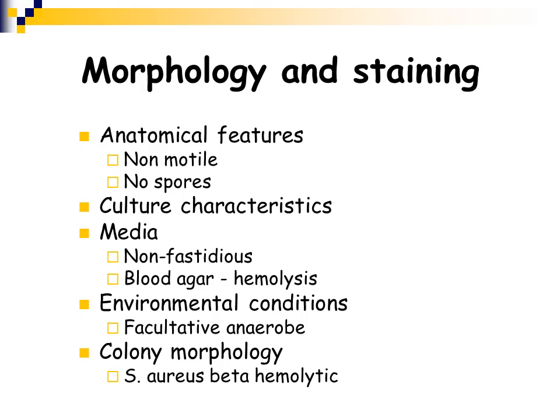And most bacteria, all non-fastidious bacteria, and also a couple of fastidious bacteria, like to grow on blood agar. It is a facultative organism, and we already mentioned that Staphylococcus aureus is beta hemolytic.